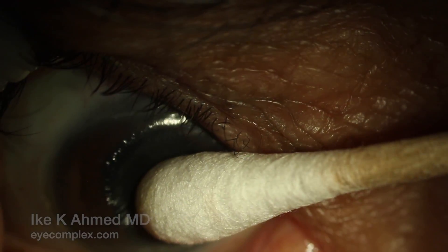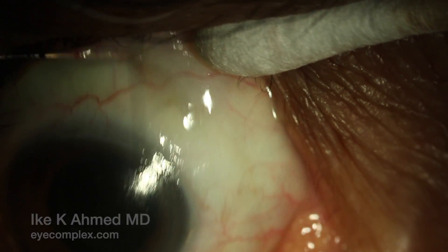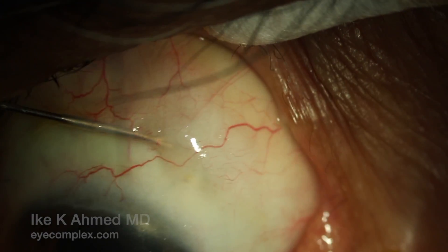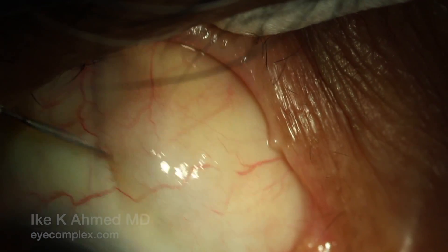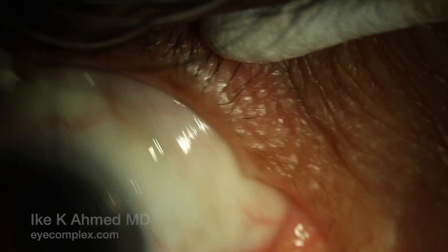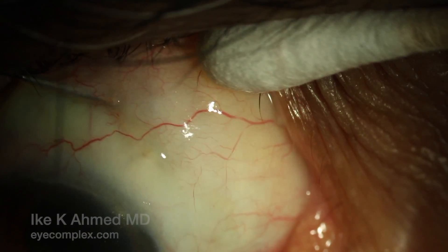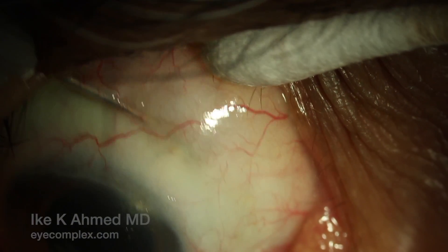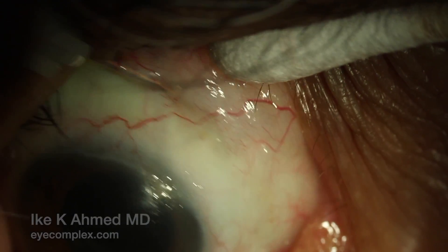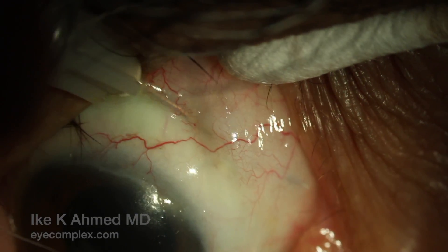You can really see a nice bleb forming here with this technique. This is done at the slit lamp. I prefer not to use a speculum; we have a Q-tip in hand to hold the lid away as well as to palpate the eye periodically. This continues, widening the subconjunctival space distal to the implant, which ensures we have a nice, well-formed posterior bleb.